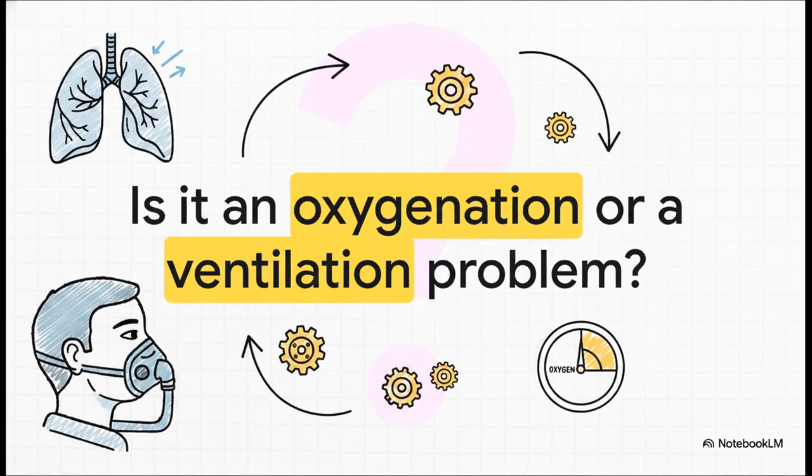I'll leave you with this final provocative thought to take into your next clinical shift. Whenever you are standing at the bedside of a struggling respiratory patient, before you even reach for a dial or call for a mask, always stop and ask yourself, am I trying to fix an oxygen problem today or a ventilation problem? Answering that single question correctly will guide you perfectly through everything we've just covered.